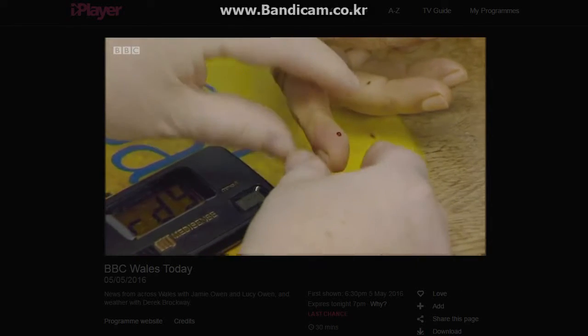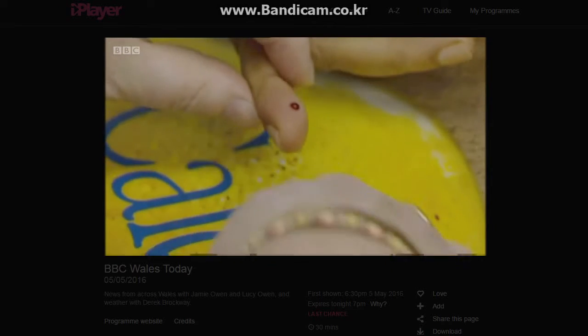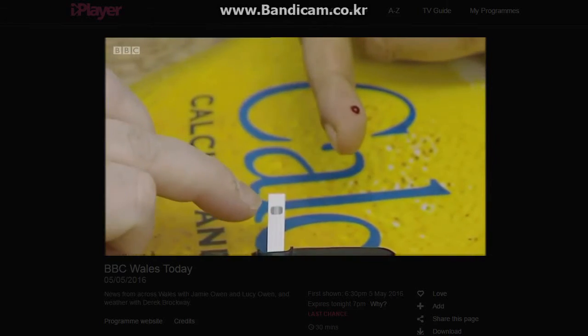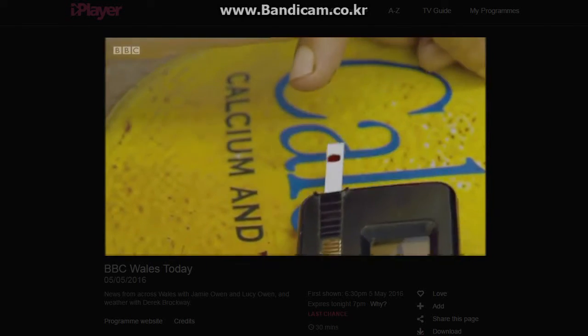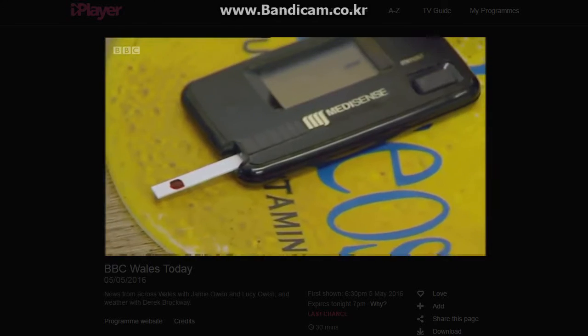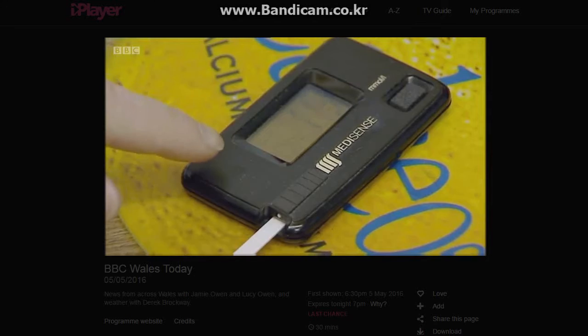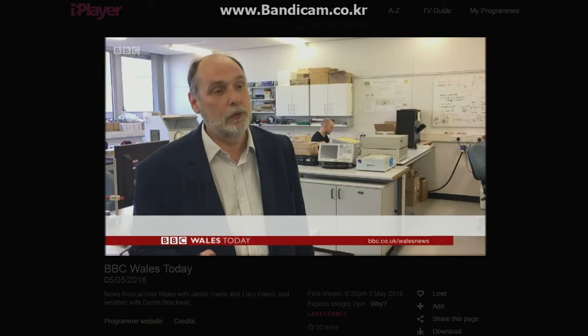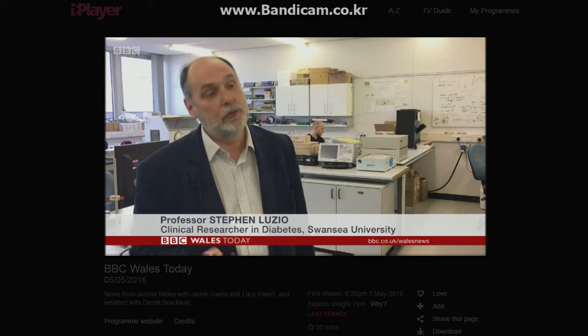Just squeeze gently, not too much, just a little bit. For diabetics, testing their blood like this is a regular occurrence to ensure their glucose levels are being controlled. Put the blood spot on the square. For some type 1 diabetics this invasive finger prick method can be an uncomfortable but necessary evil. They would normally measure their blood glucose about five or six times a day, so over the course of say ten years they'd measure their blood glucose about 20,000 times.